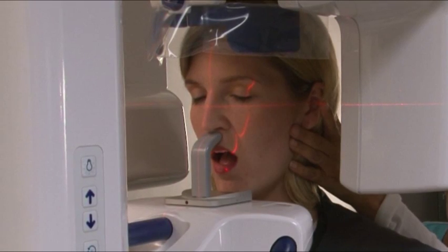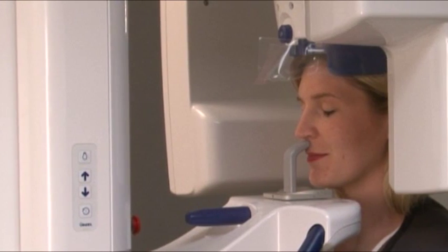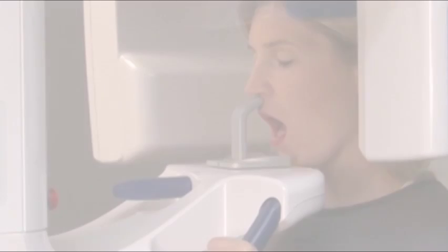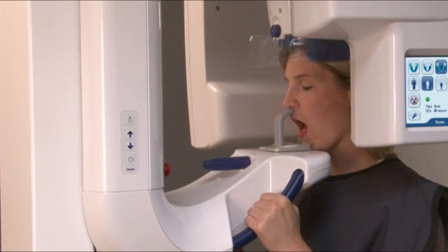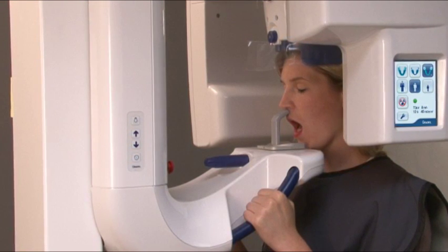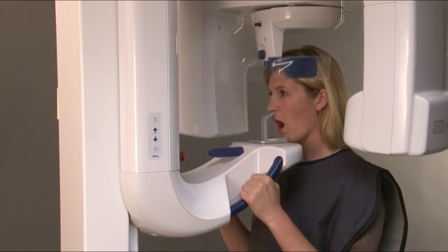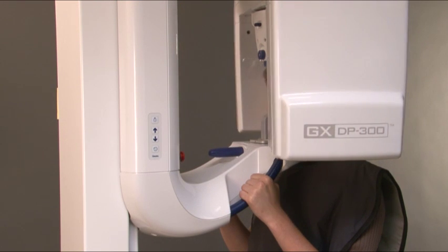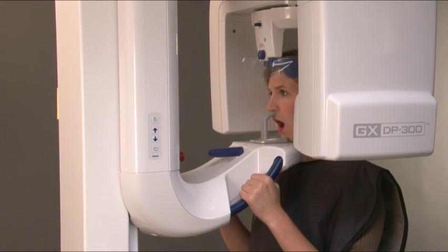Verify that the patient has not moved. Looking at a fixed point in the mirror will help them remain still for the duration of the exposure. At this point, for a closed projection, ask the patient to clench their teeth. For an open projection, ask them to open at their widest. Move at least seven feet away from the unit and protect yourself from radiation. Make sure that you can see and hear the patient during the exposure. Press and hold down the exposure button for the duration of the exposure. You will hear an audible signal and the exposure warning lights will come on. The rotating unit will move around the patient's head and then stop. When the rotating stops, the exposure has been taken.